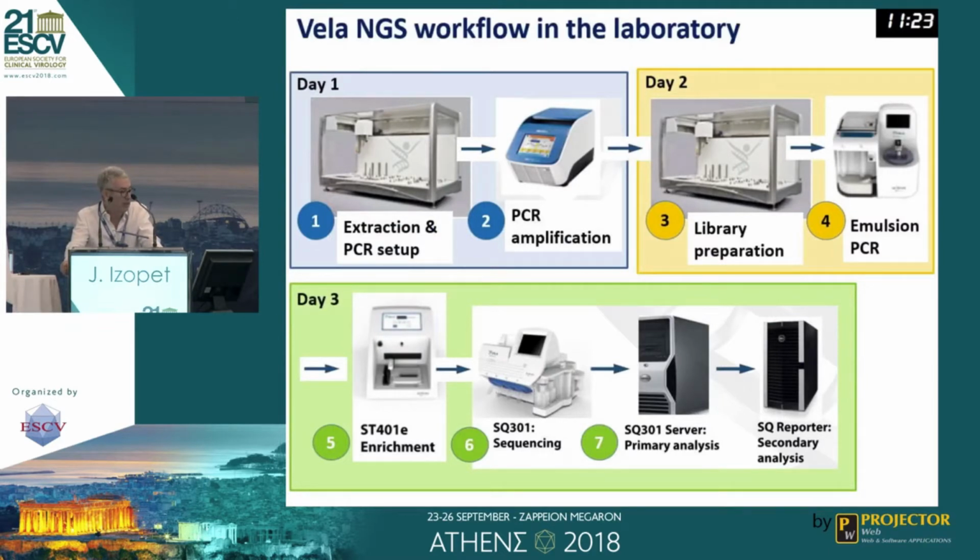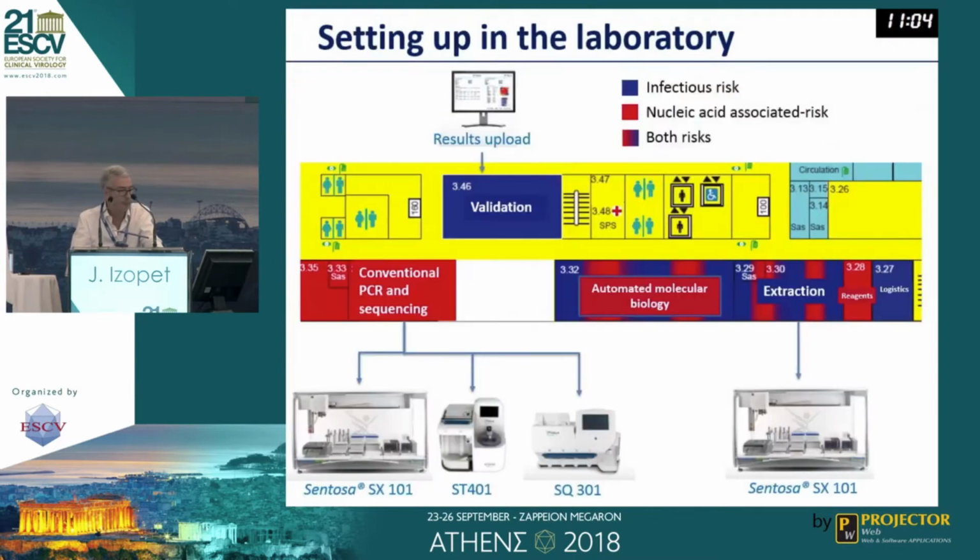The first day is dedicated to extraction, PCR setup, and PCR amplification. The second day is dedicated to library preparation and emulsion PCR. And the third day is for enrichment and sequencing and reporting the results.